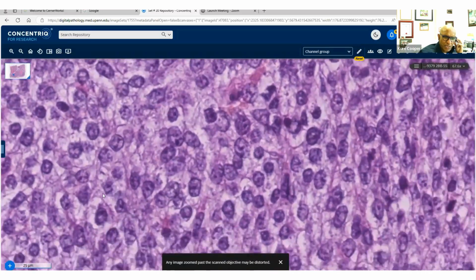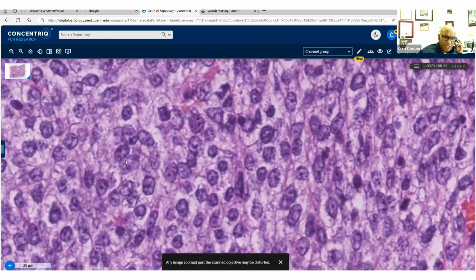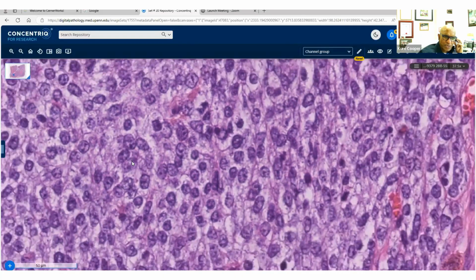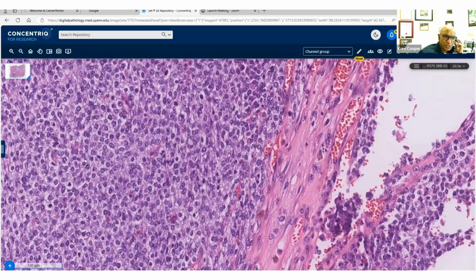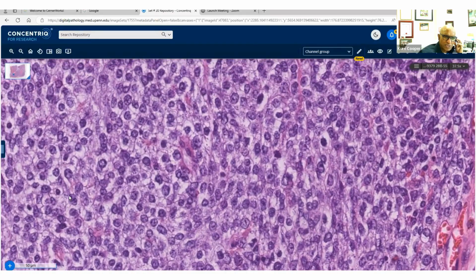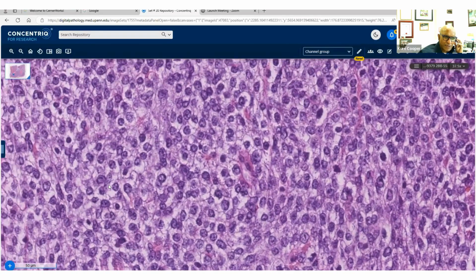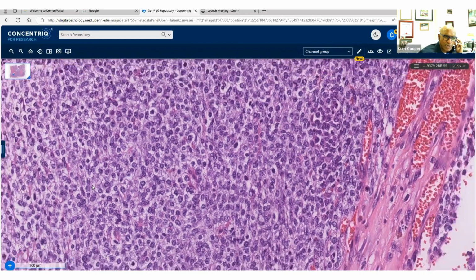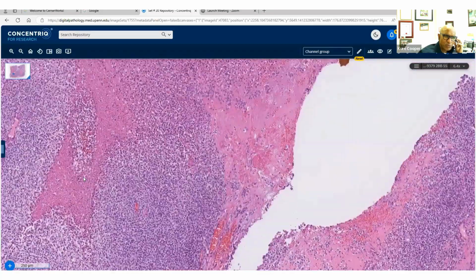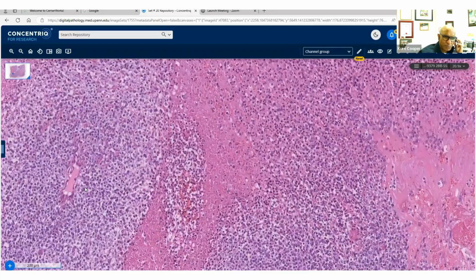It's a very good thought. The point I wanted to make about Ewing's is that these nuclei, which in some areas show pleomorphism, is not a feature of Ewing's. Ewing's is very uniform, very round. The chromatin's fine, and these look a little too large. And I was looking for nuclei that looked more pleomorphic, just to help that process along.